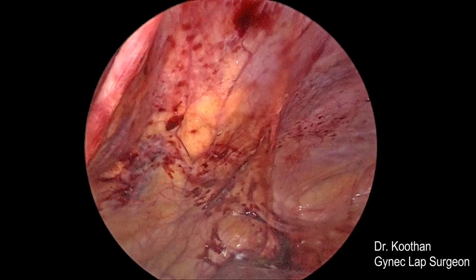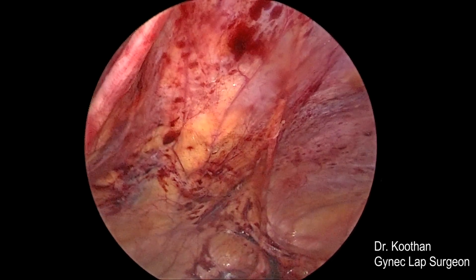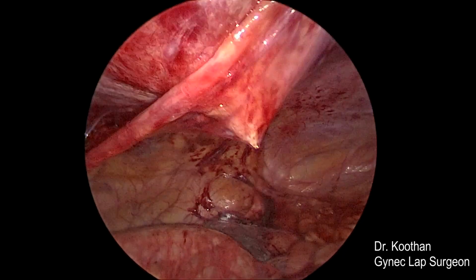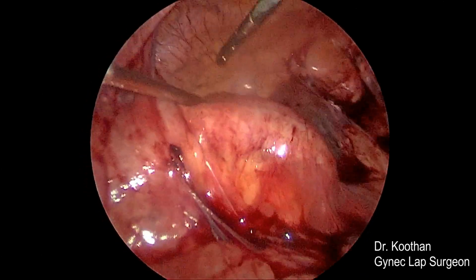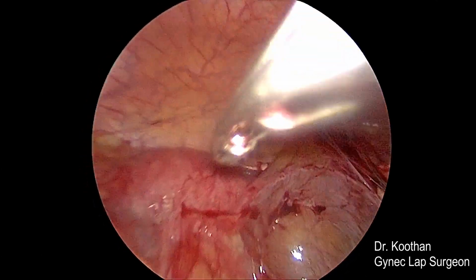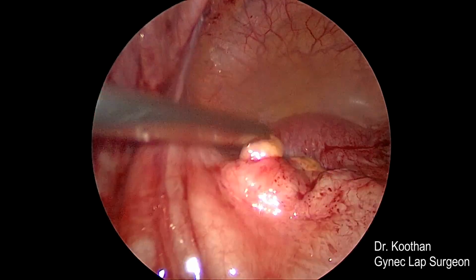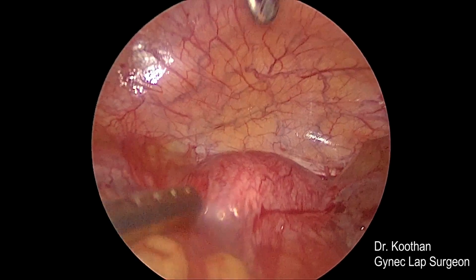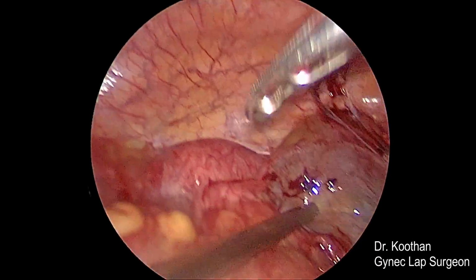Now we are planning to put the suprapubic trocar after adhesiolysis. So some of the bowel loops which were adherent to the anterior abdominal wall were released. This is the secondary trocar. Now what you are seeing is the anterior surface of the uterus and the sigmoid loops which are actually adherent to the lateral pelvic wall. So we are planning to release the sigmoid loops and also the right side there.